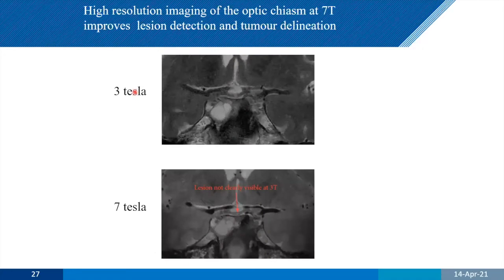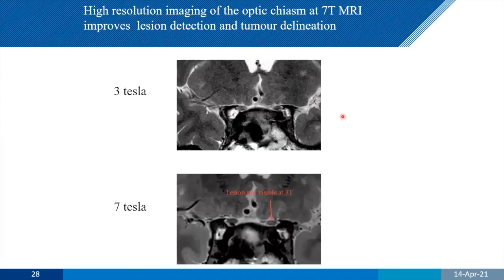The other area that we use a lot is oncology. So this is looking at lesion detection in the optic chiasm. And essentially what you're looking at is something very, very small down here, which possibly is visible on the 3T, but the accuracy or the robustness of that is much less. Second example over here, which is even more demonstrable. So you see that white lesion in the middle there, which you simply can't see at 3T. So this is where 7T, if you can get rid of a lot of those artifacts and scan safely, really has an advantage.